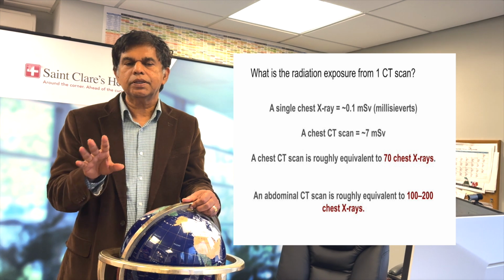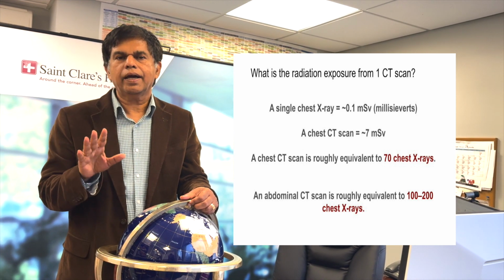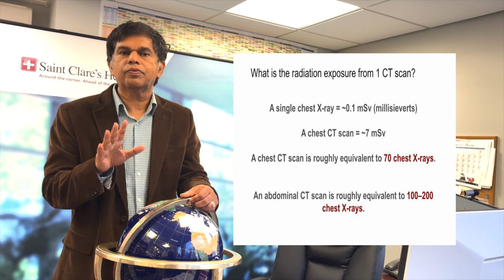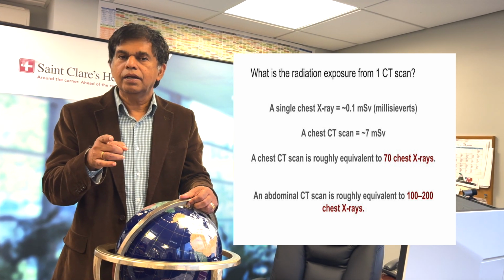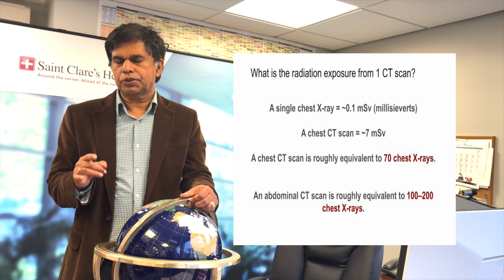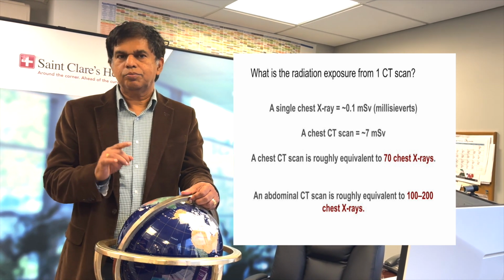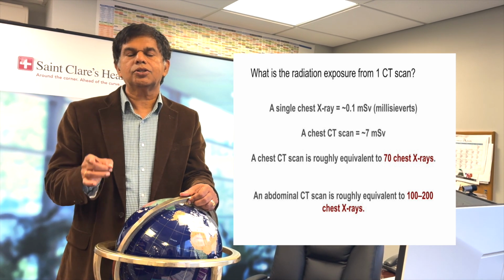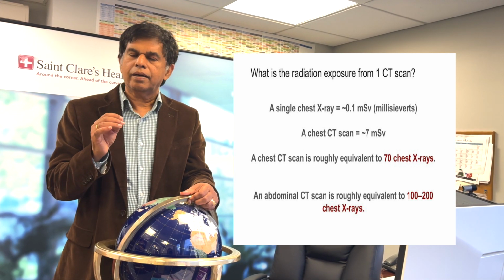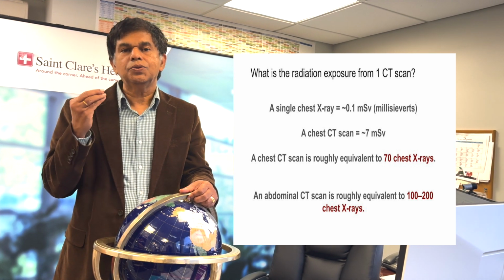So the first thing you always ask: doctor, by doing this test, can anything happen to me? Is there a risk of radiation? All right, so the first question you should ask is, is there a radiation risk? If somebody ordered a CT scan, or computed tomography scan, we call it a CAT scan, the first thing you should ask is, hey doc, am I exposed to radiation? Okay, you are exposed.